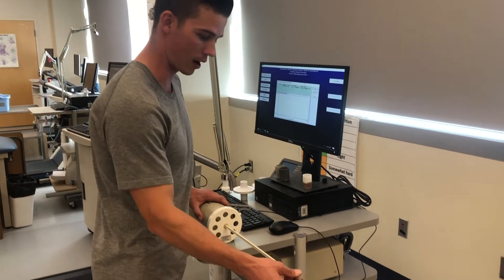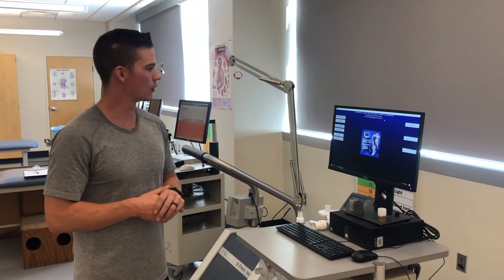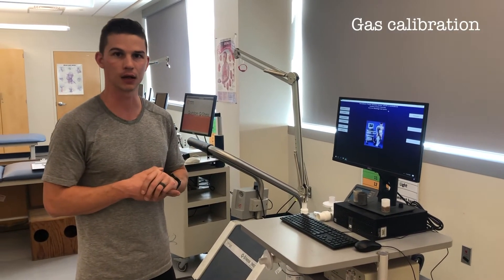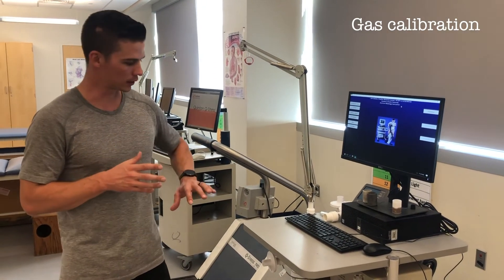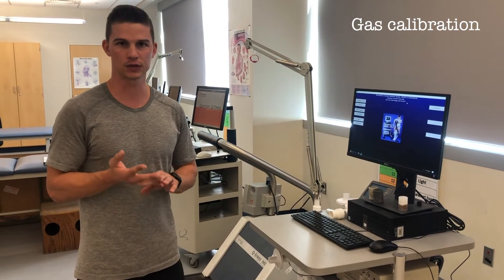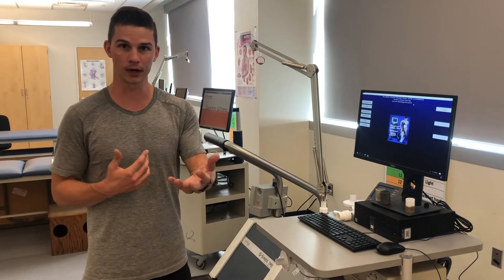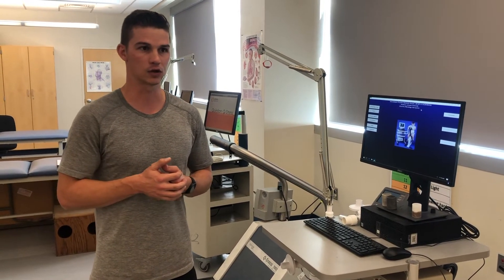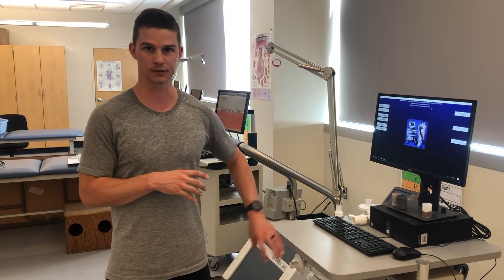The next thing we need to do to prepare for a VO2max test is to calibrate the gases. We want the cart to be able to detect changes in the amount of oxygen and CO2 that we are expiring, because that gives us an idea of how hard the individual is working from a metabolic perspective. To do that accurately, we need to calibrate the gas analyzers in the metabolic cart.